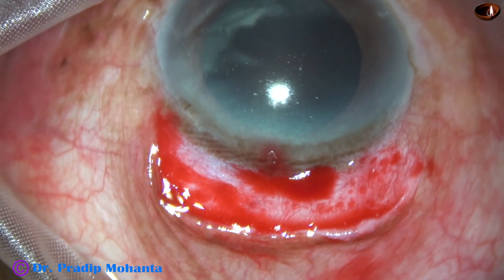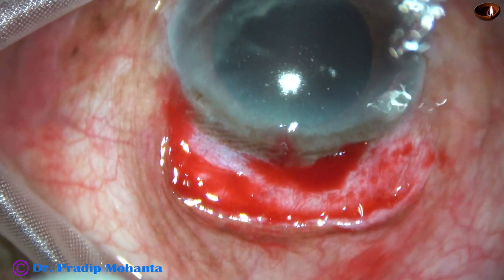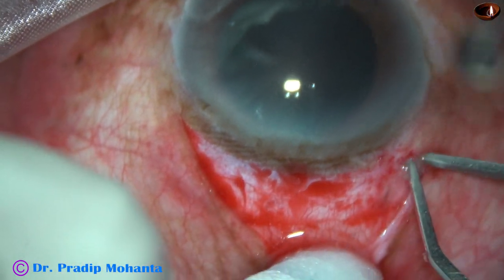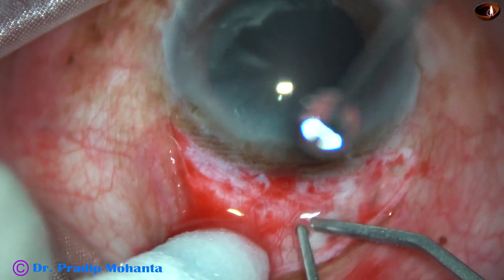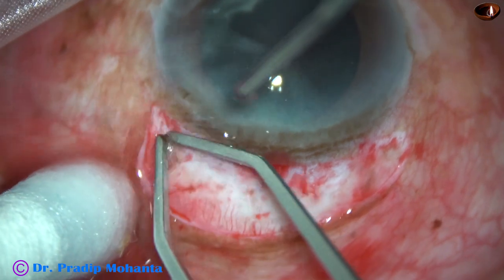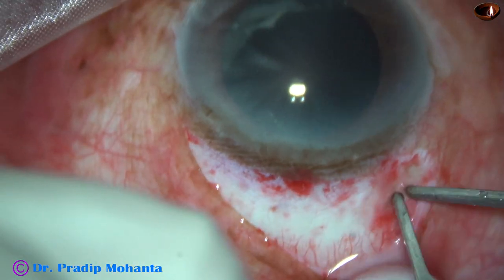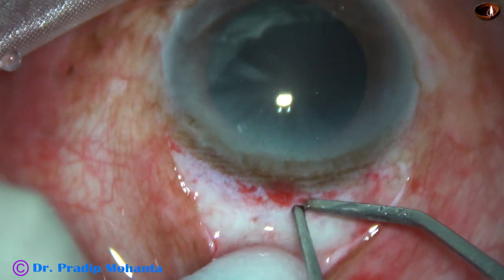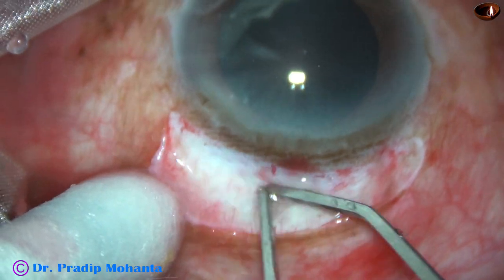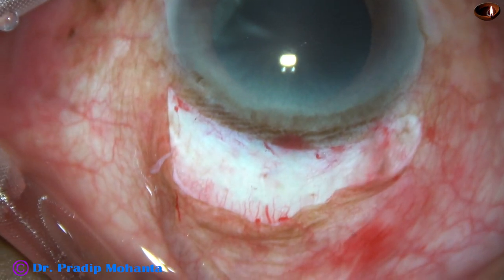Now we are going to do bipolar cautery. In this case, I am planning two SICS incisions which will be placed adjacent to each other. This is the bipolar cautery, which is very mild. You must just touch on the blood vessels and immediately come out, and the assistant must keep on instilling drops of Ringer's lactate or BSS.